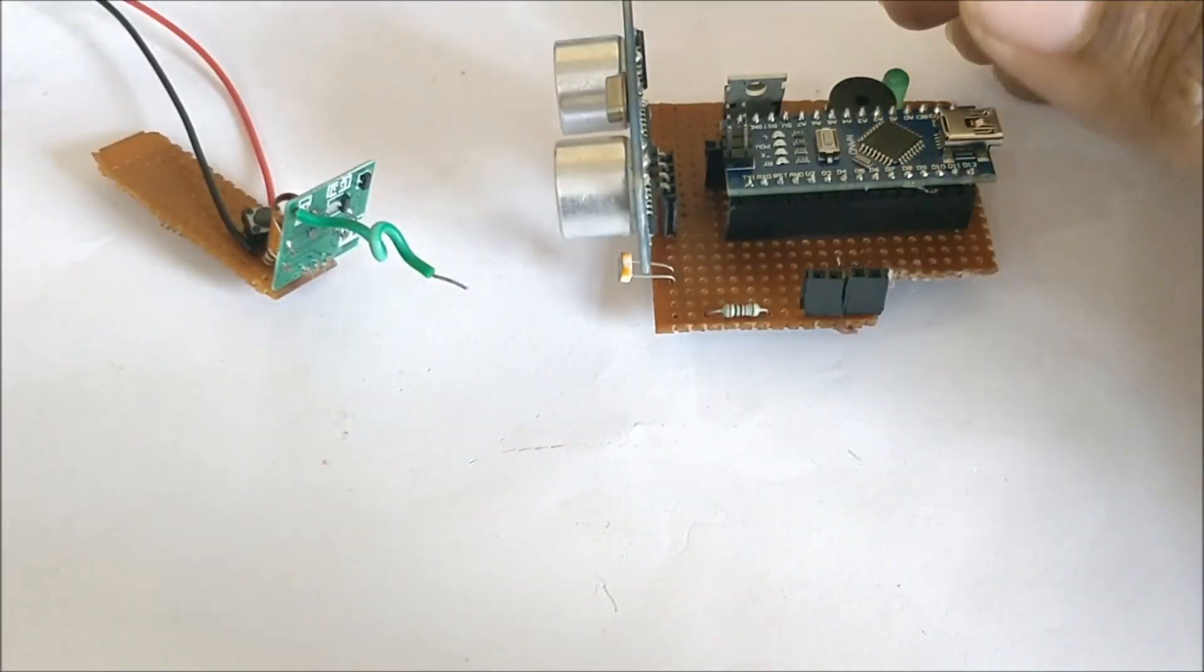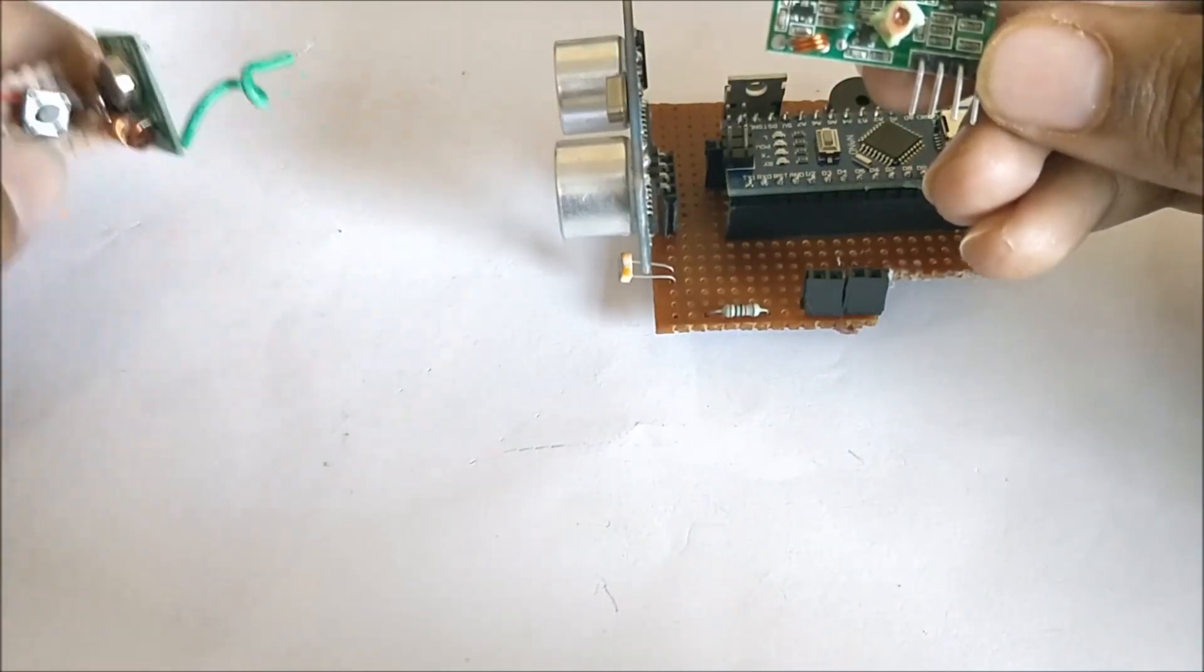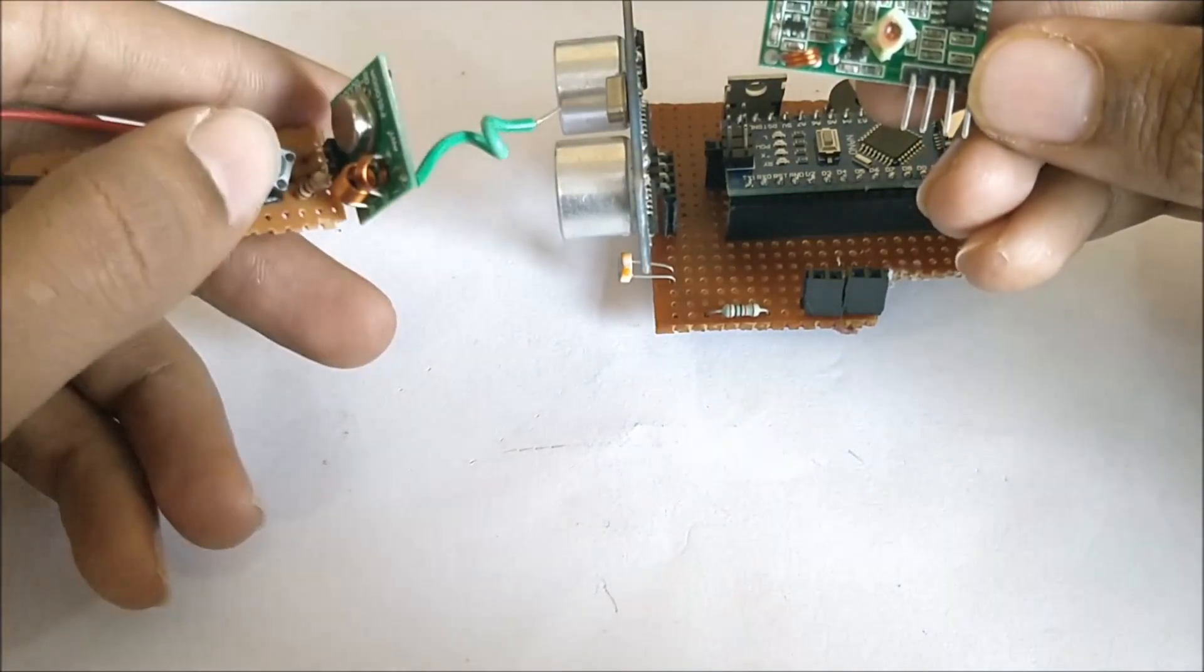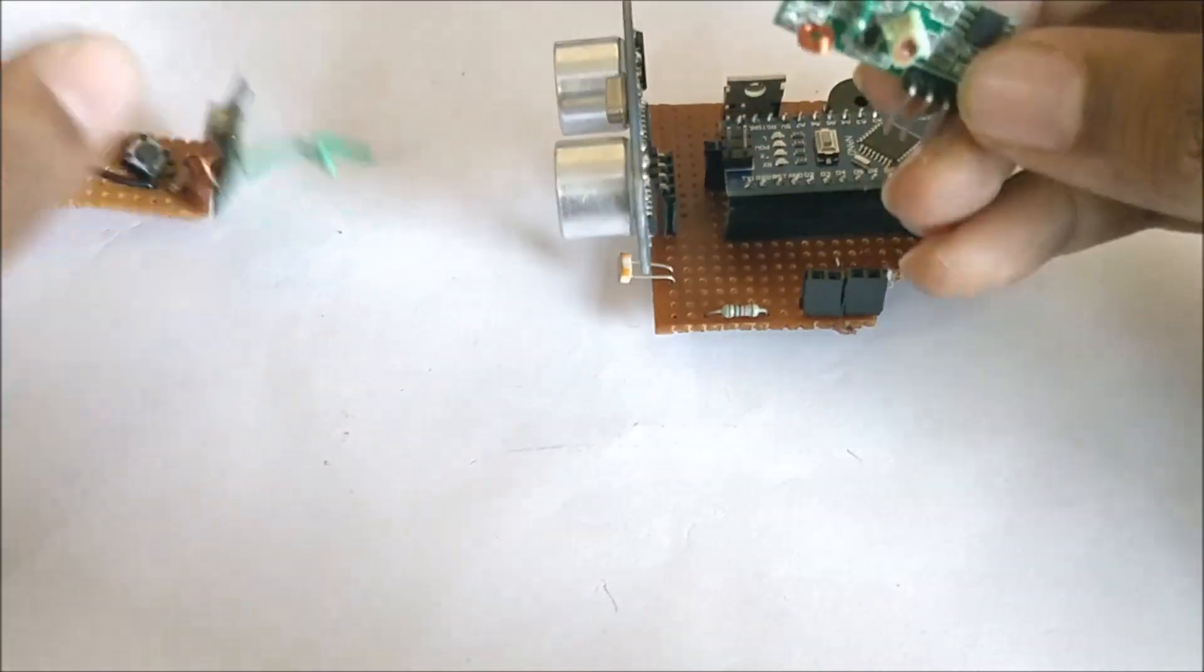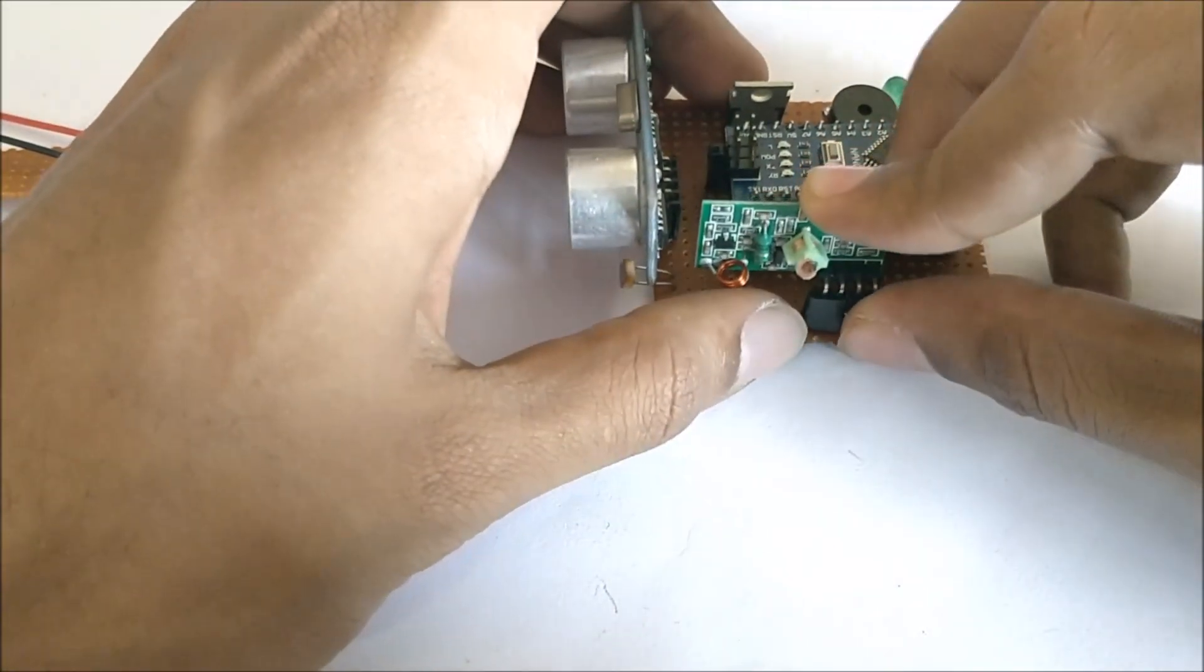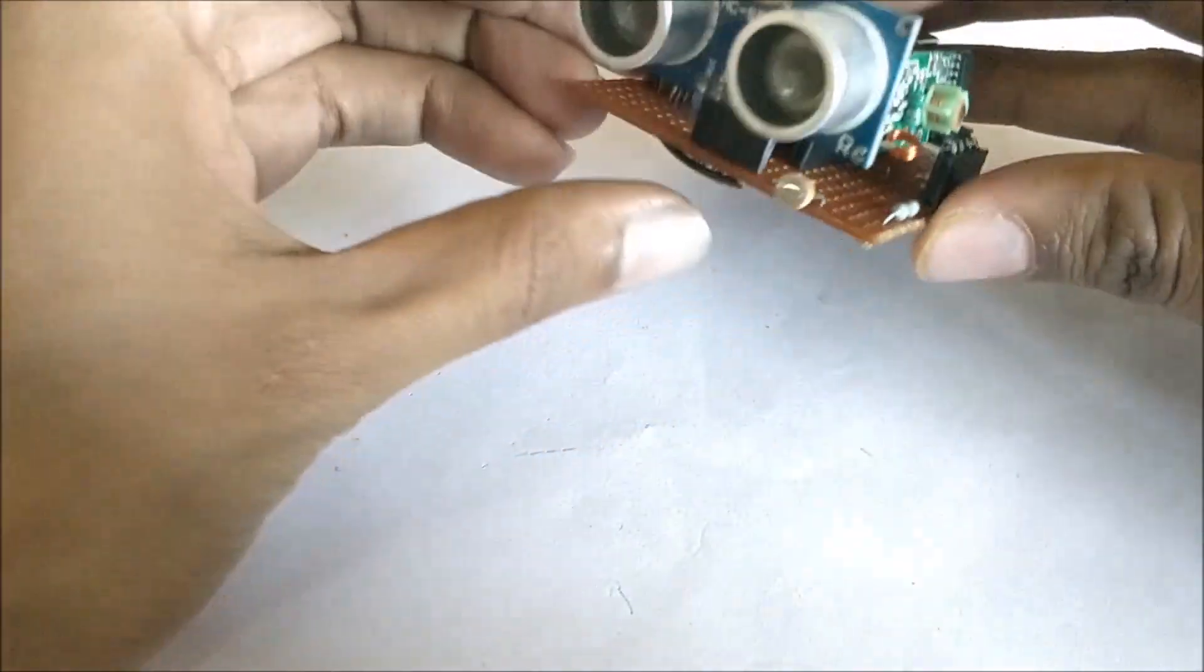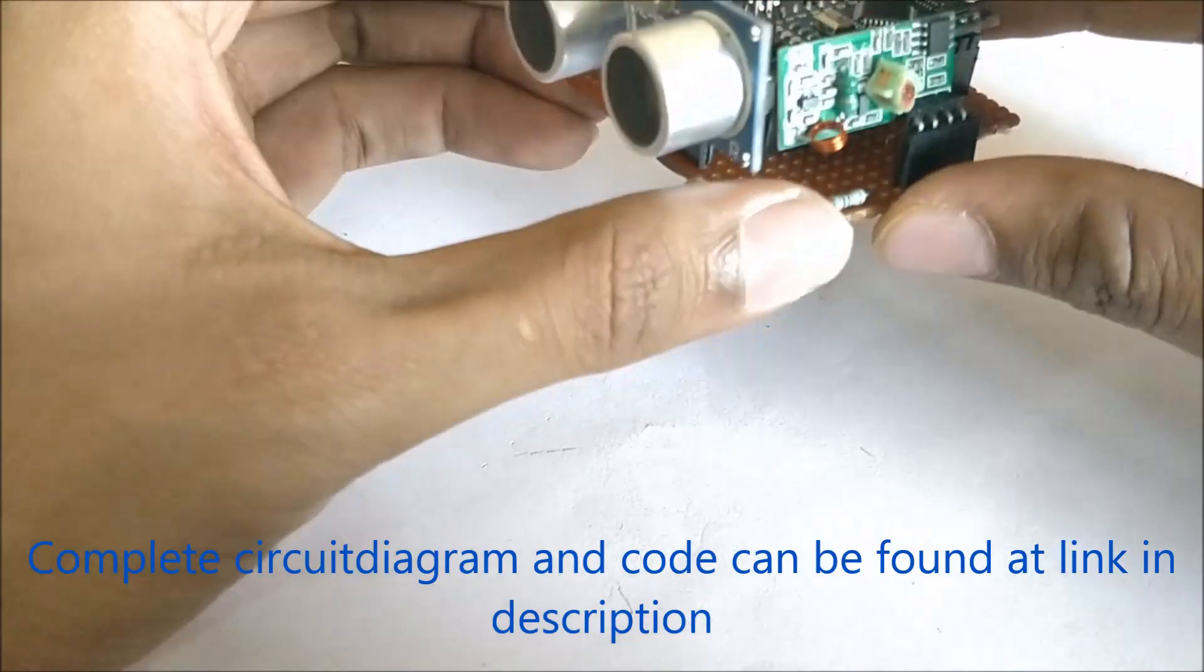We have the IR receiver over here. Whenever the user presses the button from this transmitter, the receiver will receive the signal and the Arduino will react to it. Let me plug in the receiver. Okay, now everything is in place. The ultrasonic sensor will measure the distance, and the LDR will check for the intensity of light around the blind person.